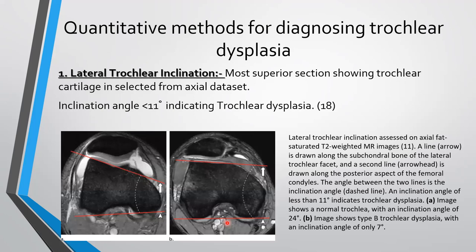Quantitative methods for diagnosing trochlear dysplasia: lateral trochlear inclination is assessed on the most superior section showing trochlear cartilage from the axial dataset. On axial fat-saturation T2 MR imaging, a line is drawn along the subchondral bone of the lateral trochlear facet, and a second line is drawn along the posterior aspect of the femoral condyles. We measure the angle between them. If it is less than 11 degrees, there is trochlear dysplasia.